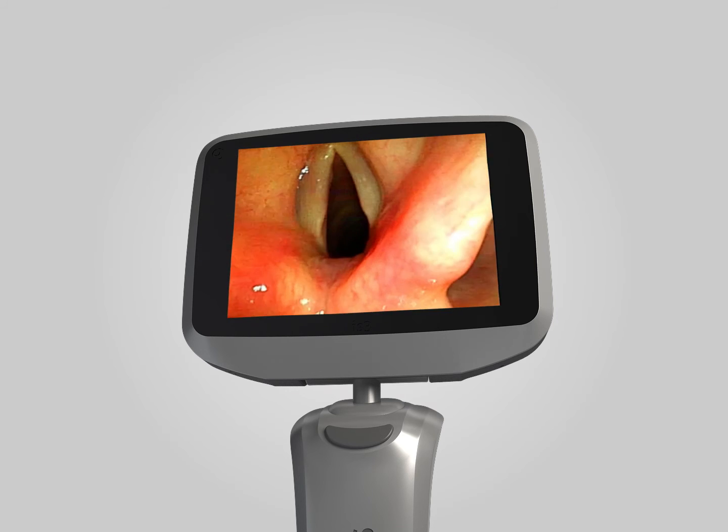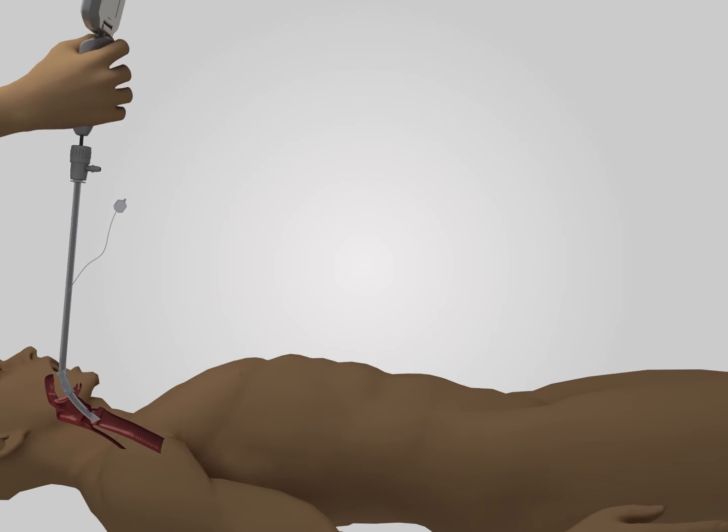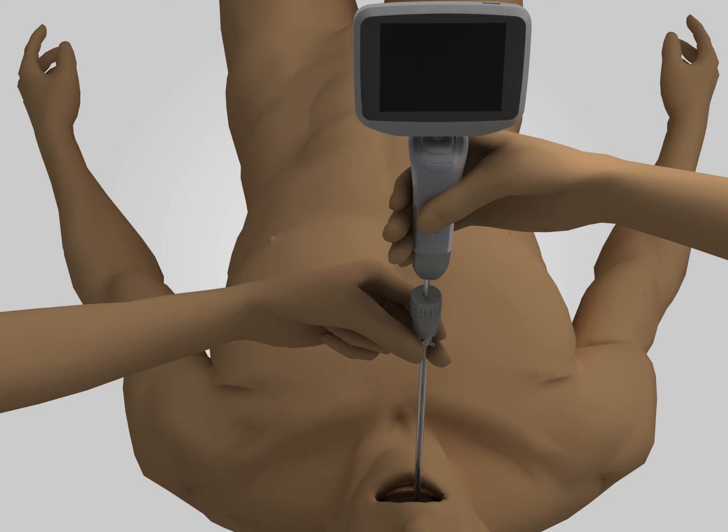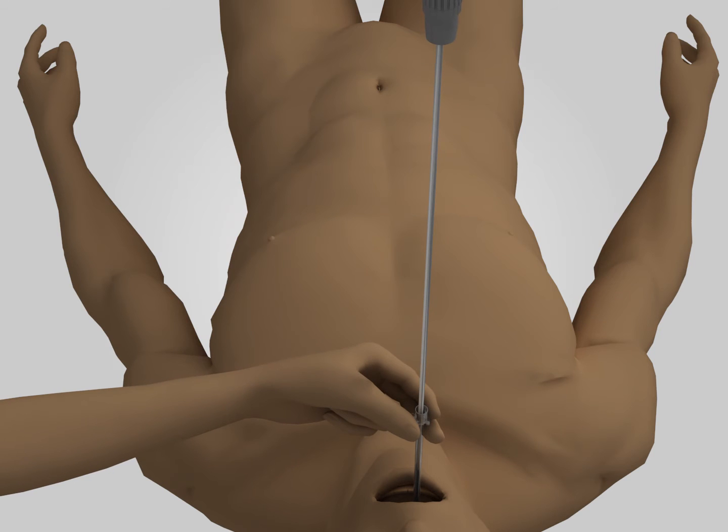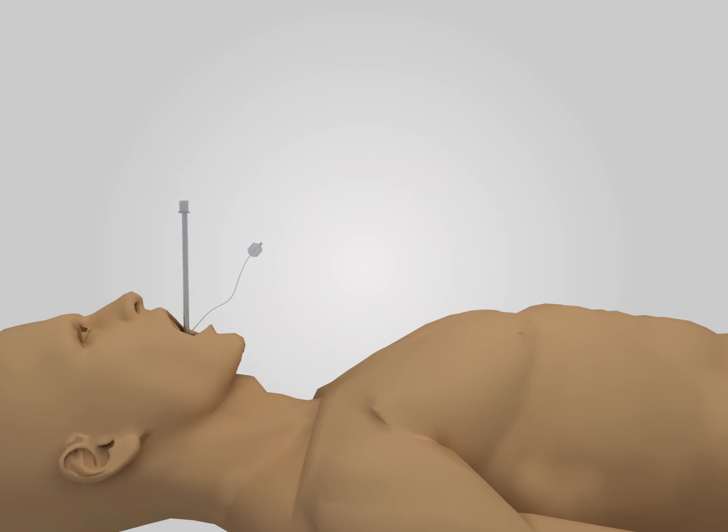Gently push the tube inside the glottis for 1 to 2 centimeters, then use the left hand to continue to push the endotracheal tube forward. Use the right hand to pull out the rigid laryngoscope, then push the tube into the proper position and fix it.